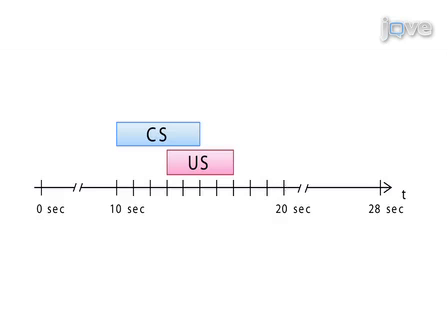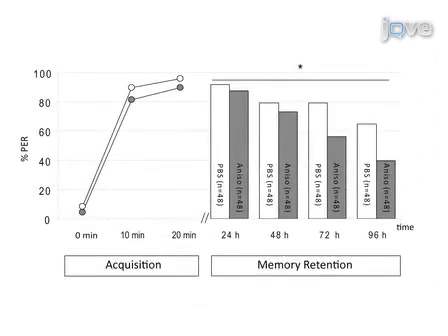Drugs can be injected at certain time points around conditioning in order to study their effect on learning and memory formation. The final step of the procedure is to test memory retention. Ultimately, changes in behavior after drug treatment may reveal the molecular mechanisms underlying learning and memory formation in honeybees.